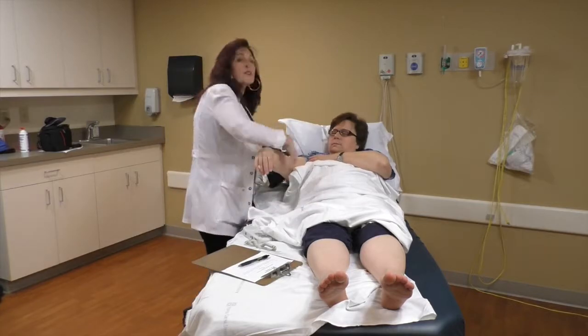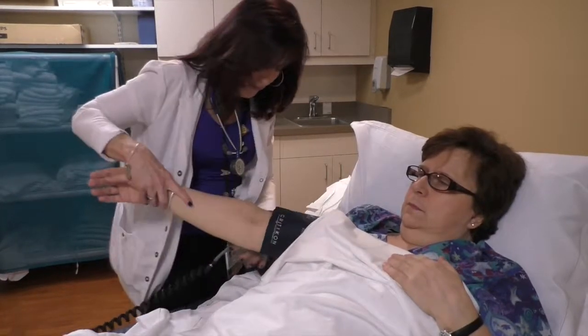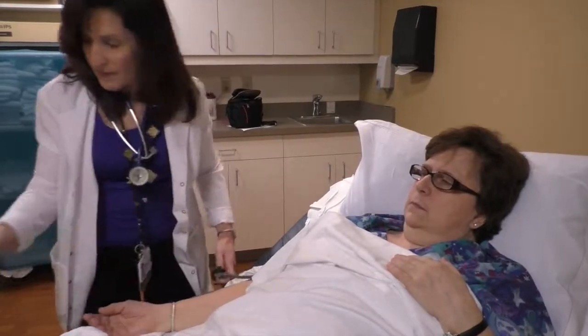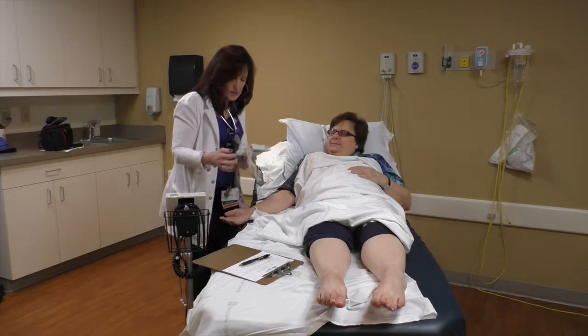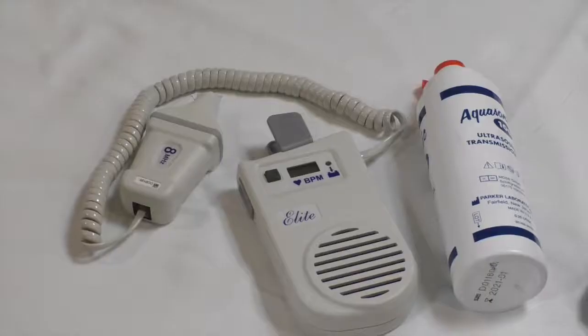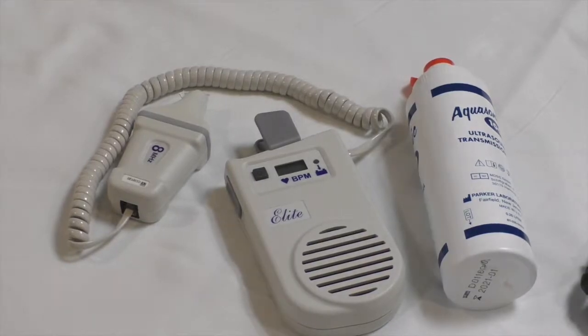I'm going to put a blood pressure cuff on her arm and we're just going to put a little bit of gel on her arm — it's a transmission gel. This is a handheld Doppler; it uses ultrasound and it listens to your arteries.